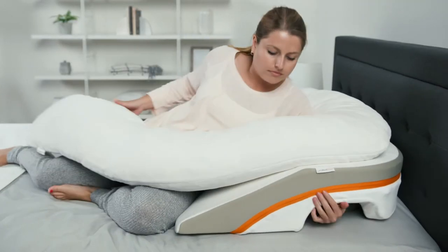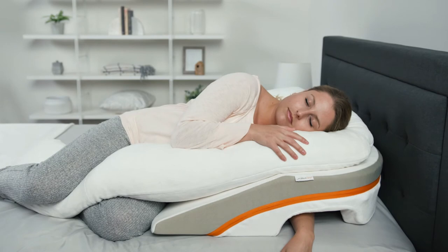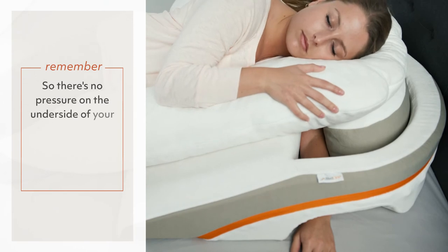Then lie down by allowing your elbow to ultimately rest on the mattress. Once you have settled in with the side of your chest on the reflux relief wedge, your lower arm and shoulder should no longer be supporting your weight.